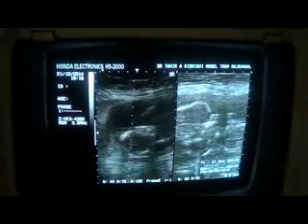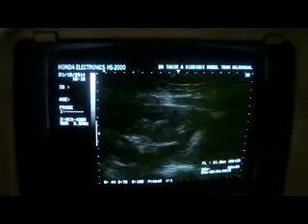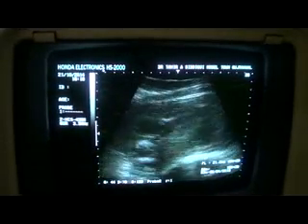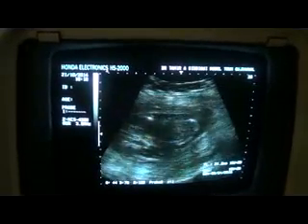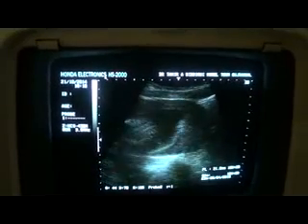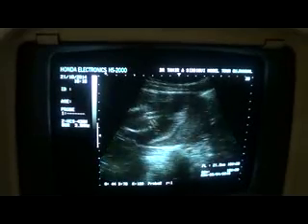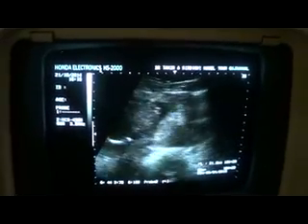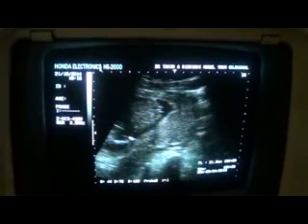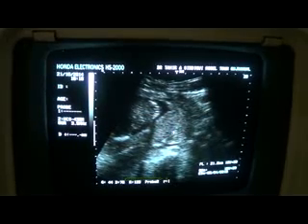And there is no anomaly seen relating to the fetus. So all the issues relate to the uterus in the form of a fibroid just above the posterior lip of the uterus and the lowermost uterine segment.